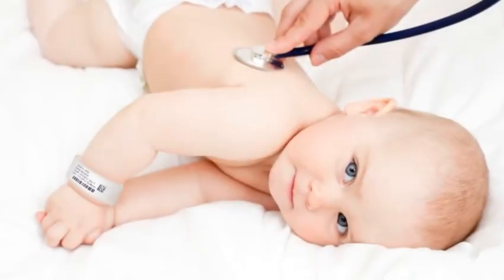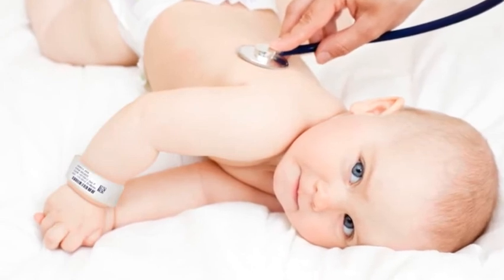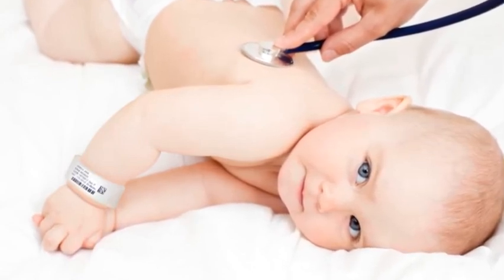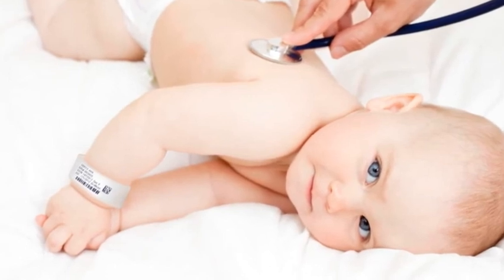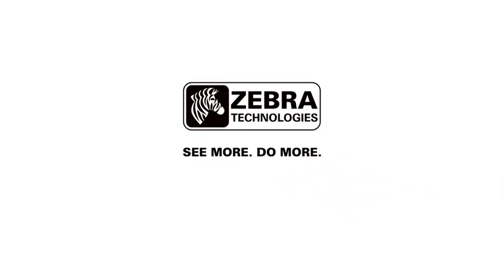Fit the Comfy Cuff on the infant's ankle and lay the Velcro tab over the padded material to secure it. The Laserband Infant Wristband provides a safe, secure and simple system for identifying your small patients and giving them the comfort and protection they need. For more information about Zebra and our entire line of laser and thermal wristband solutions, please visit www.zebra.com.